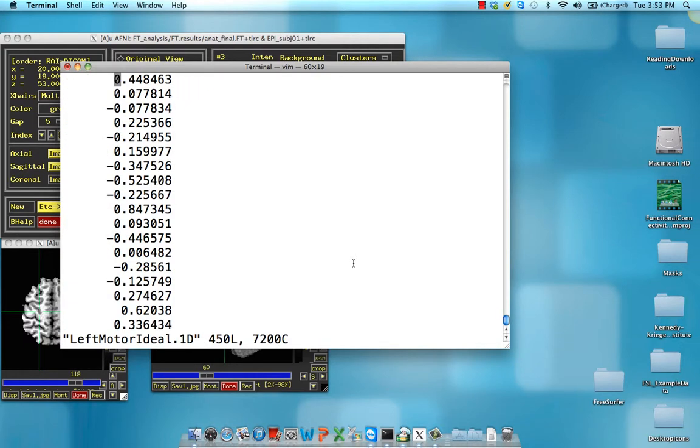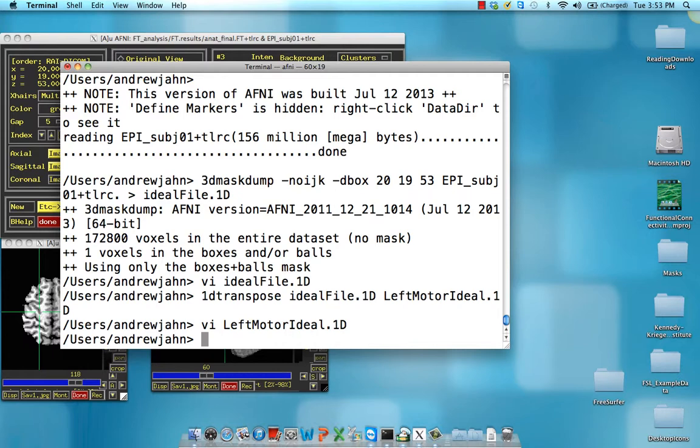Let's check it out just to make sure it looks good. And it does. So we have that, and now we're ready to actually run the functional connectivity analysis.